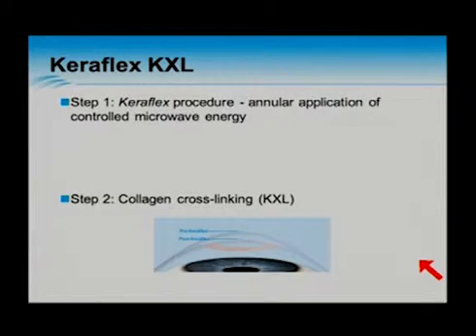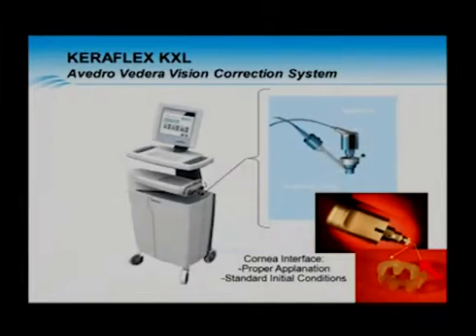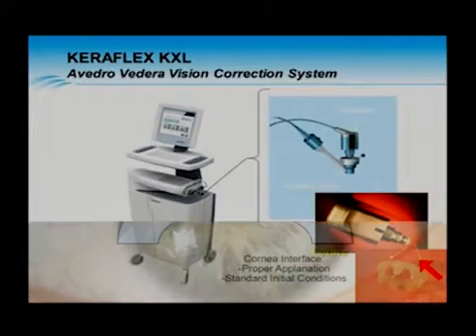The procedure involves an annular application of microwave energy to flatten the cornea in combination with collagen crosslinking. And the crosslinking is important because otherwise the cornea tends to resume its original shape after reshaping. Here's the current iteration of the system. A suction ring is placed on the eye. The microwave application device is applied. The treatment takes less than 1 second.